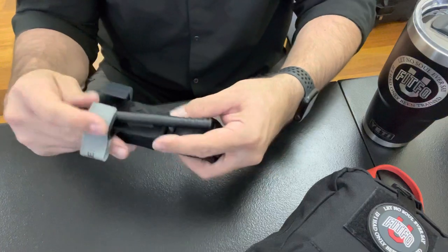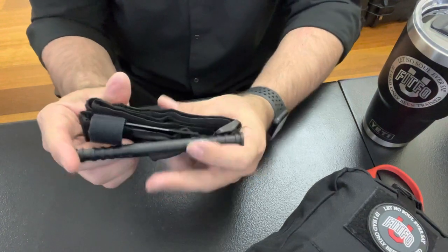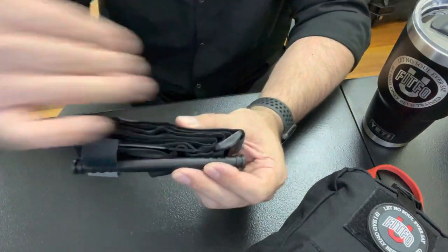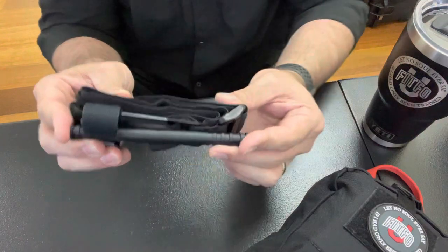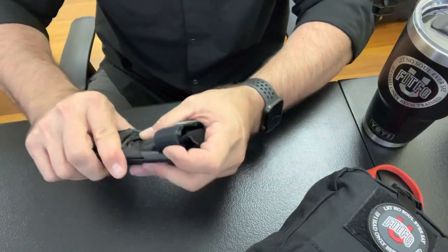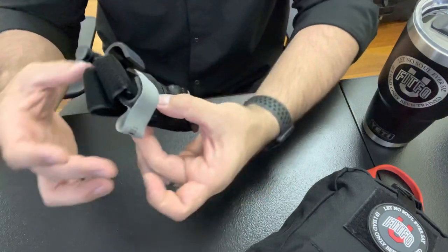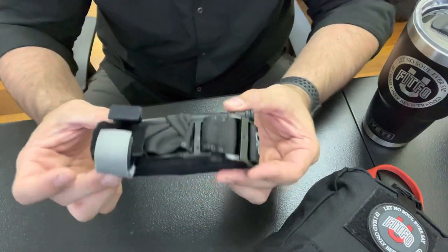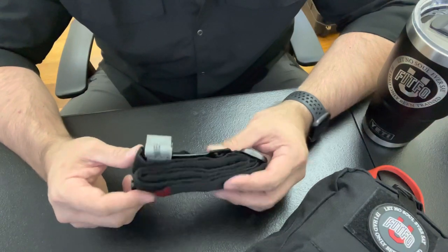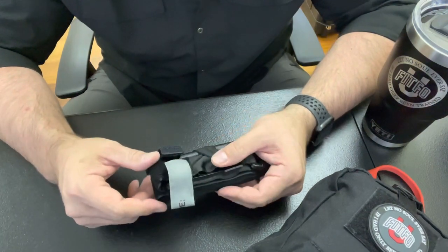If you get this set up right, the tourniquet ends up the exact length of the windlass — you can't get it any smaller than that. I usually tuck the windlass over to the side, and now it's a nice, compact, tucked package — all set up just as small as you can get it. That's how I prep a CAT tourniquet. Personal preference applies — if it works for you, great; if not, just make sure what you're doing is evidence-based.